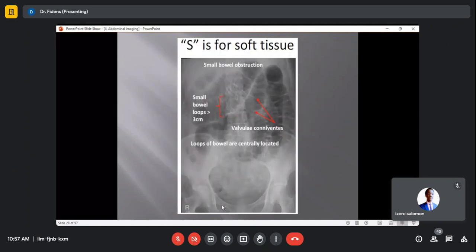Okay, good. Here they just want to insist on what you have to check for in S. Remember ABCS.